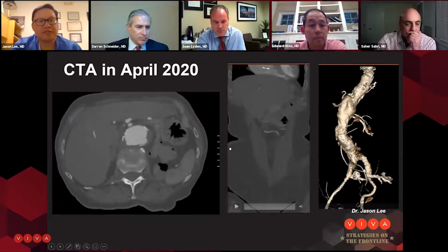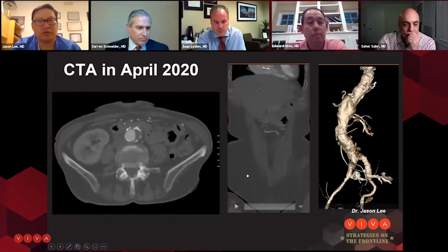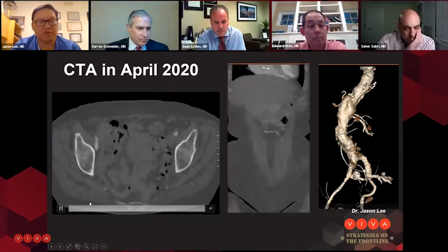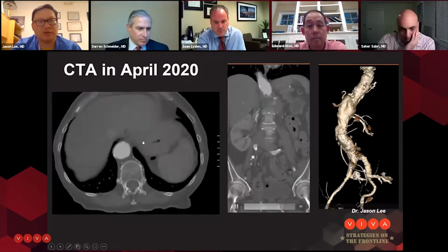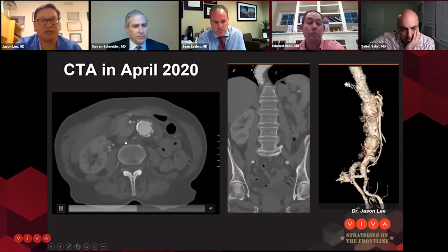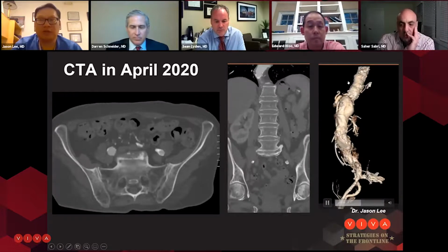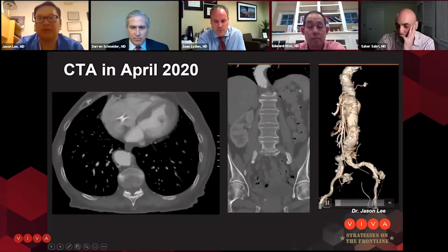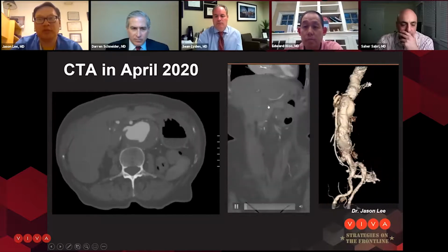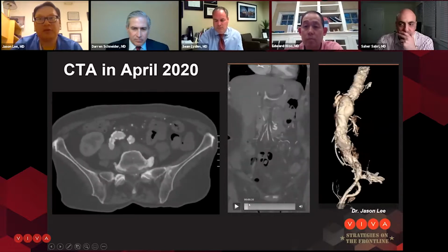COVID, of this suprarenal aneurysm. I'll scroll through it again here, and then I'll show you the coronals and the 3D here. Access quite calcified, relatively skinny lady from her smoking, I'm sure. And as you look at it from the top, it kind of starts right at the diaphragm, maybe right at the celiac, the single solitary kidney without any significant stenosis of those. And on the 3D here, a quite downward angulation to both the SMA as well as the renal. And if you look carefully here on the coronal, an early branch off of that lone renal as soon as it comes off.